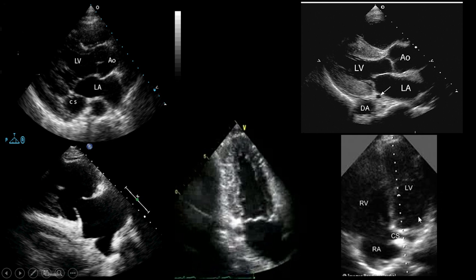In apical 4 chamber basal view, when we have apical 4, if we fan the probe toward the bed, we can start seeing the basal view, that shows us this coronary sinus vein here as a duct opening to the right atrium, or maybe we can see it in subcostal 4 chamber view too.